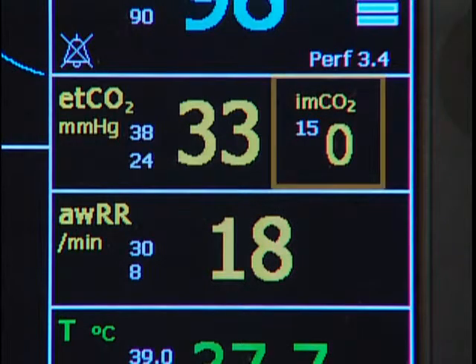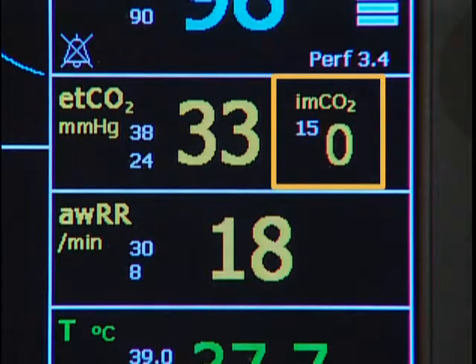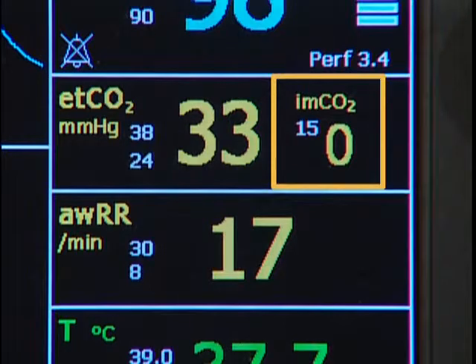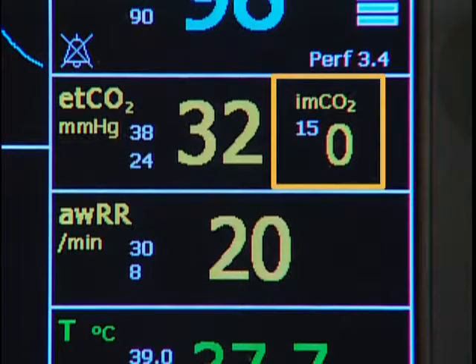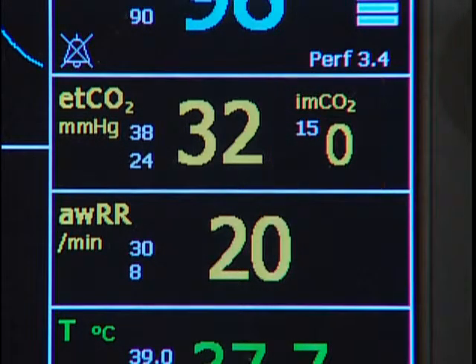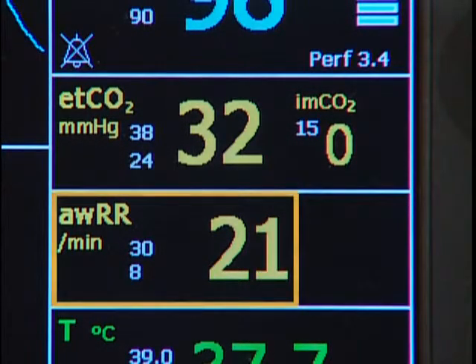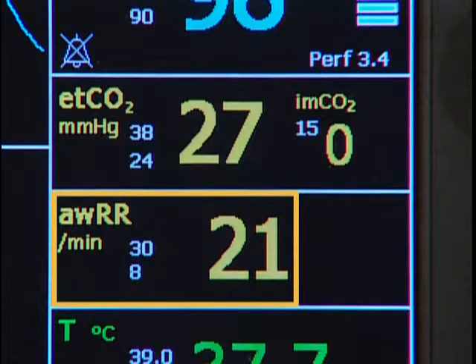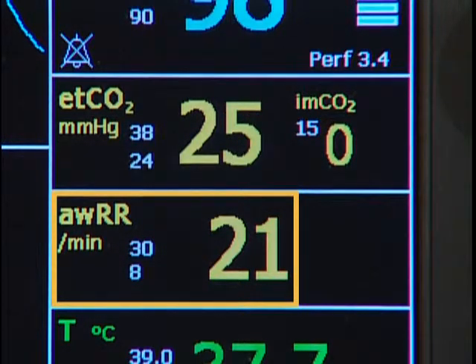The second is IMCO2, or inspired minimum carbon dioxide, which is the lowest CO2 value measured during inspiration. And the third is AWRR, airway respiration rate — the number of breaths per minute.